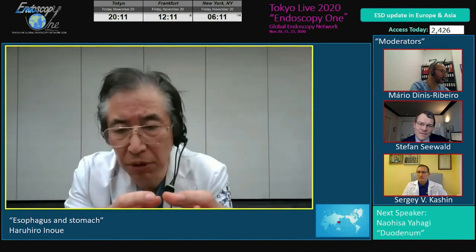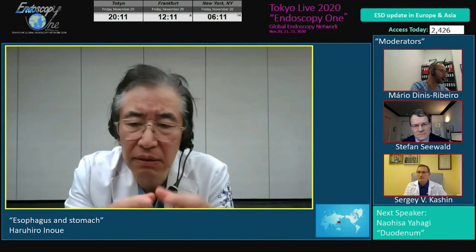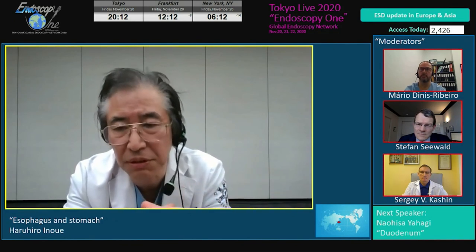For a large GIST tumor, I think it's better to do it laparoscopically. But for a 1 or 2 centimeter small GIST, I think we can do it endoscopically. Because the tumor size is limited, we can keep some distance from the surface to avoid injury to the capsule of the GIST. In some cases, subserosa dissection, by which I mean preserving the serosa layer, is completed, and I showed 2 cases. Both cases are small GISTs, less than 2 centimeters. In one case, we could preserve the serosa layer. In the other case, it became a full thickness resection.